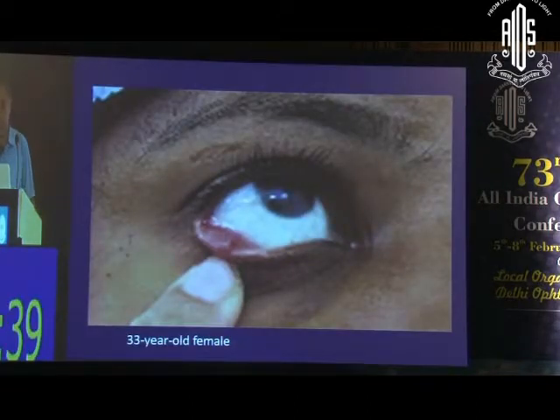Okay, now this was a 33-year-old female who presented with this mass on the lower eyelid. What do you think it is?